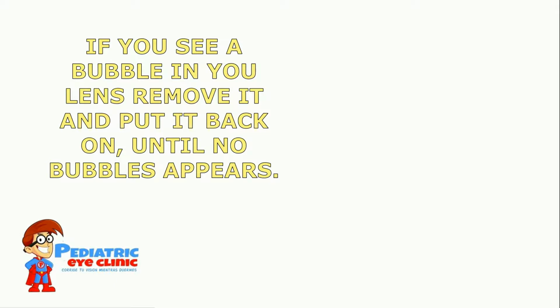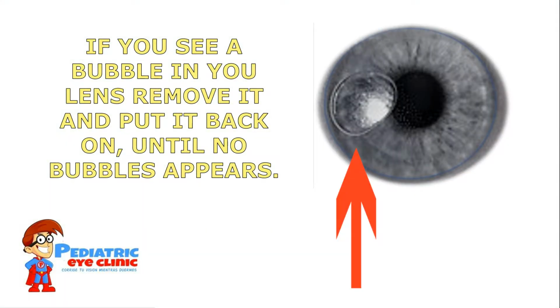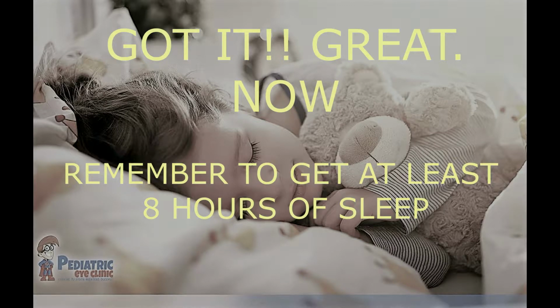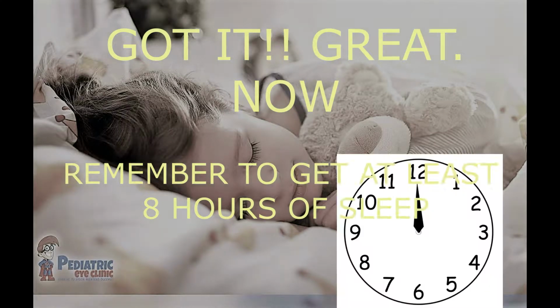Well done. Now that you have your lenses on, look straight in the mirror and make sure there's no bubbles, like the one in this picture. If there's any bubbles, remove your lenses and place them back on until no bubbles appear. Got it? Great! Now you're ready to go to bed. Remember to get at least 8 hours of sleep.